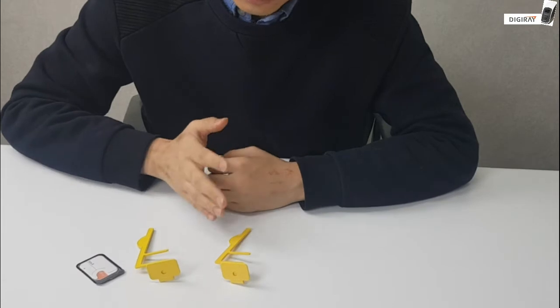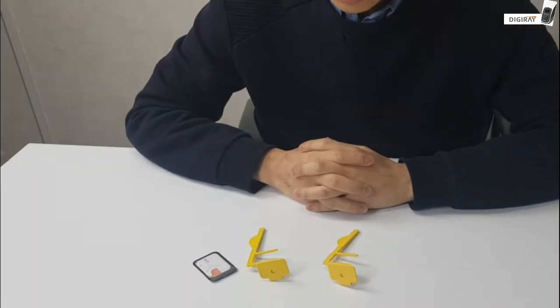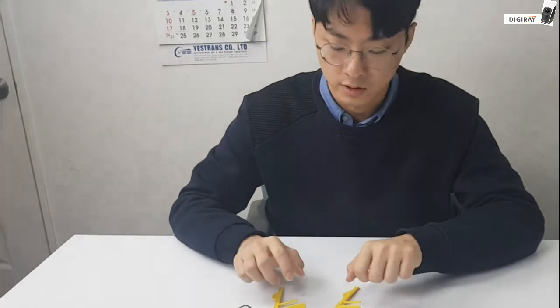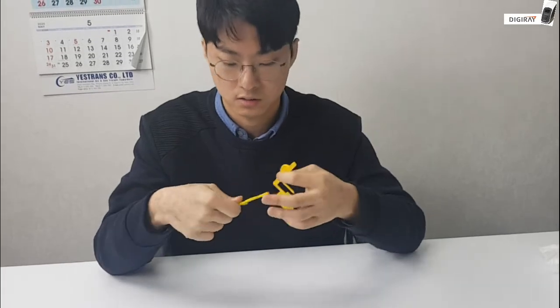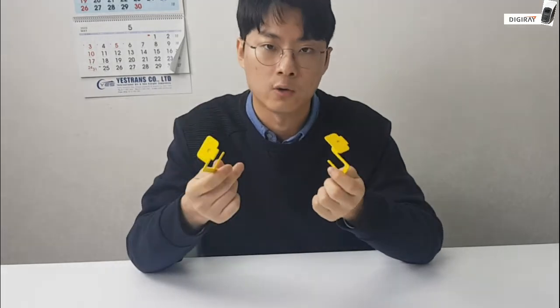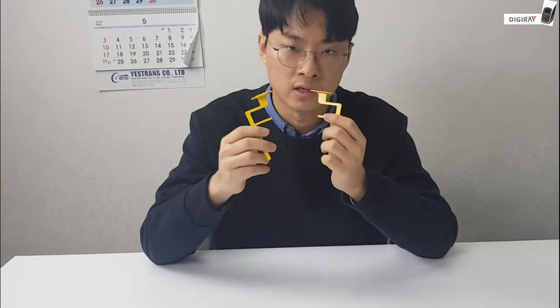As you can see, we have two of the same bi-wings in a set. The reason for that is that usually when operators use the bi-wing, they take both sides of the patient's mouth simultaneously. That's the reason why we have the two of the same bi-wings in the same set.